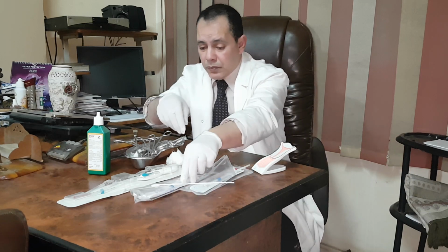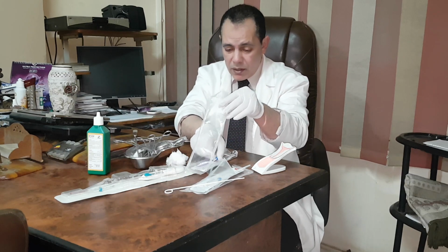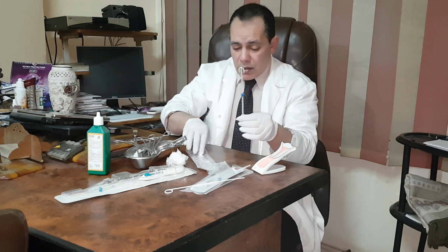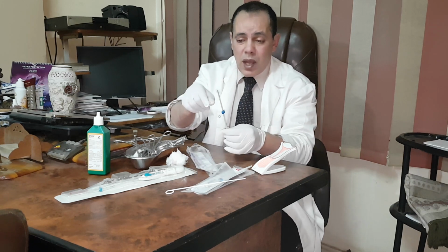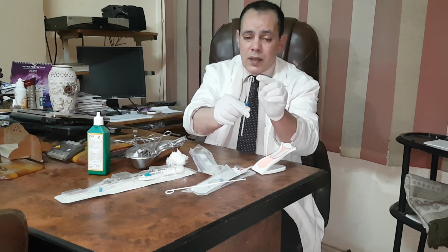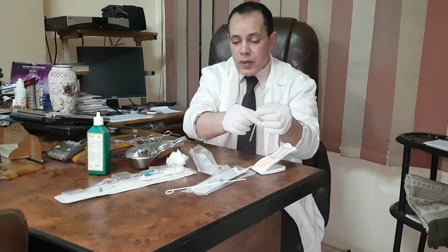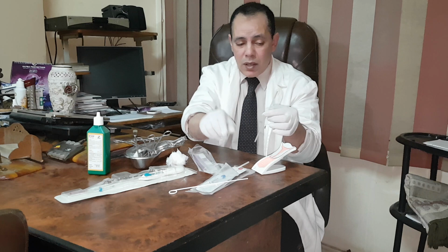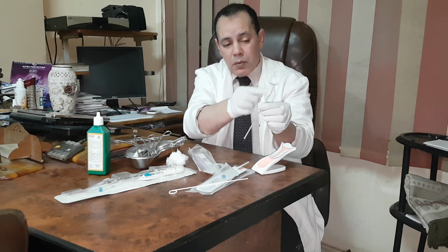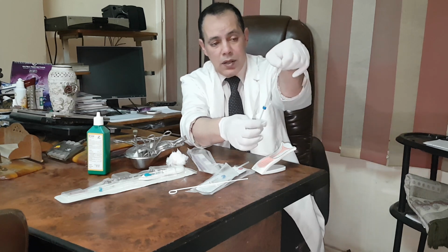Another type of IUD here, it's also copper, but it is different in its component. We said this one is 380, this one 375. Can you see this duration and this curve? It is different from the T-shaped copper T. Here the copper is in the vertical arm only, as you see here.